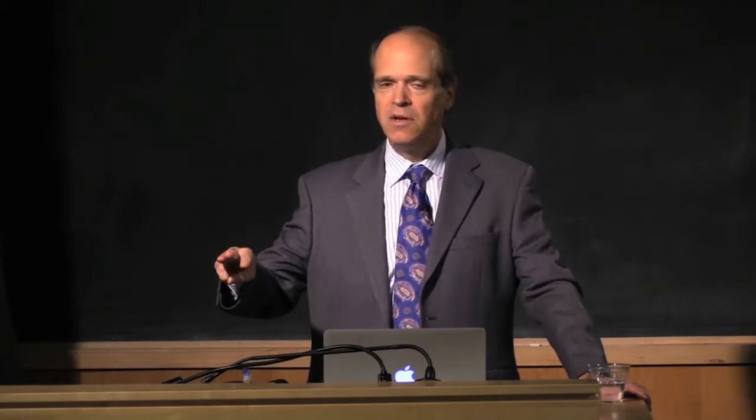And so we're handing clinicians not just a yes, no, or no result. We've chosen to hand them the 3 numbers. Some healthcare systems, they just hand them the interpretation. They don't hand them the numbers. But we think that there's actually value in the raw numbers, and that this can help the clinicians make a more accurate contextual diagnosis in the context of the subject's particular situation. But maybe arguably could be adding to confusion that, like, well, what are all these numbers? Well, just give me the answer. Is it positive or negative? So that is a little bit of an issue there.